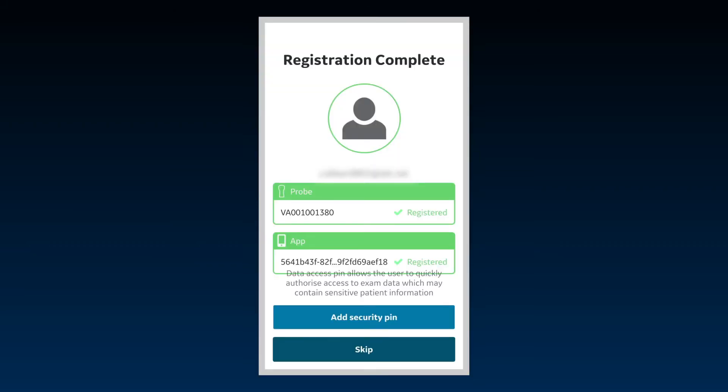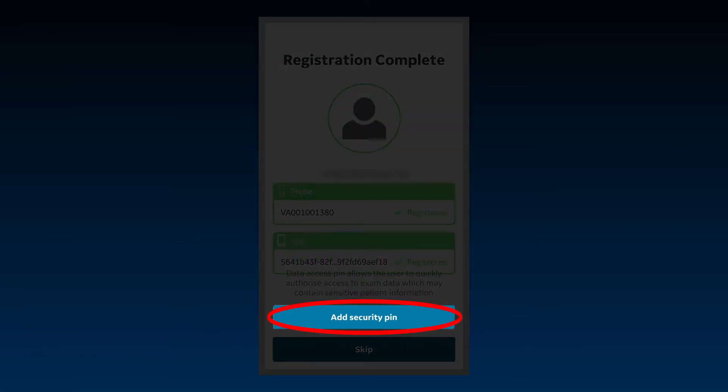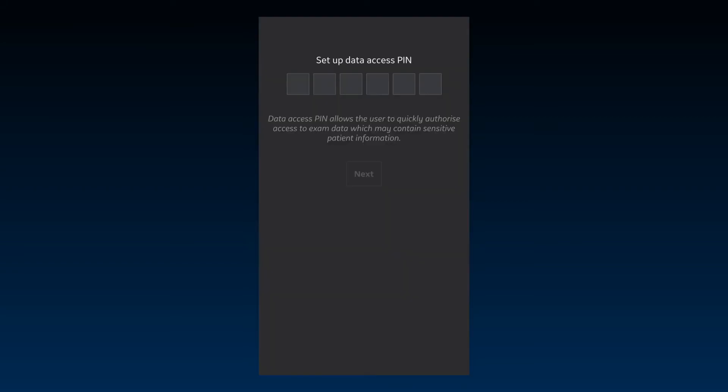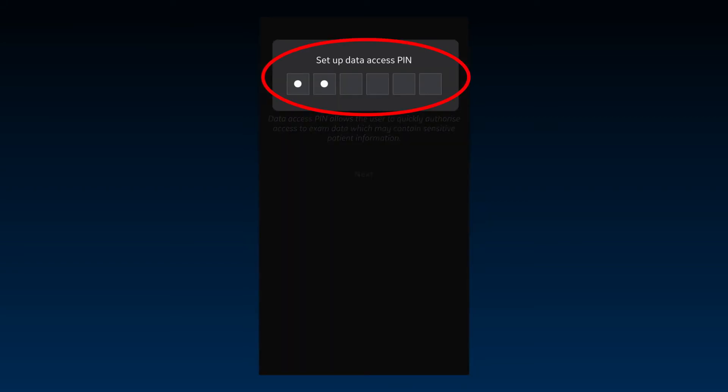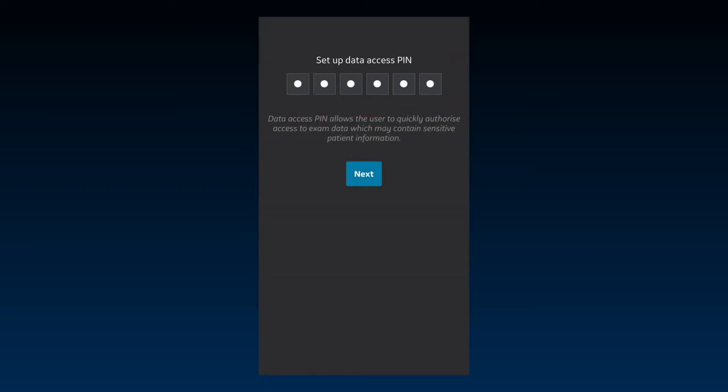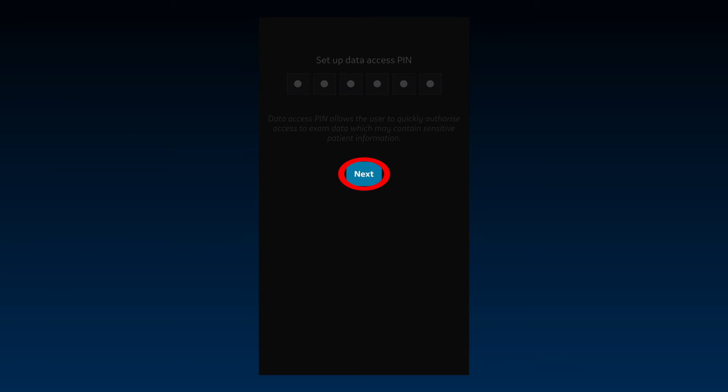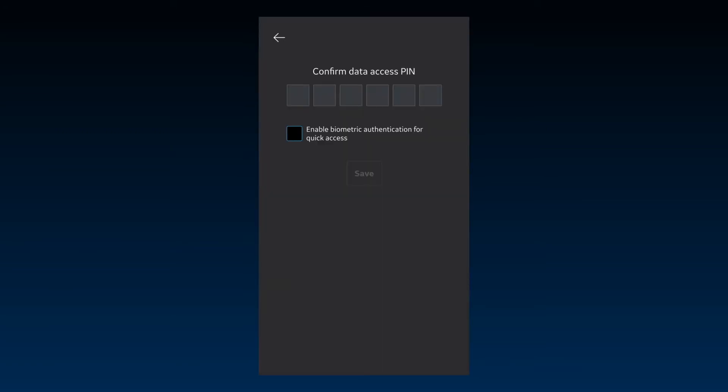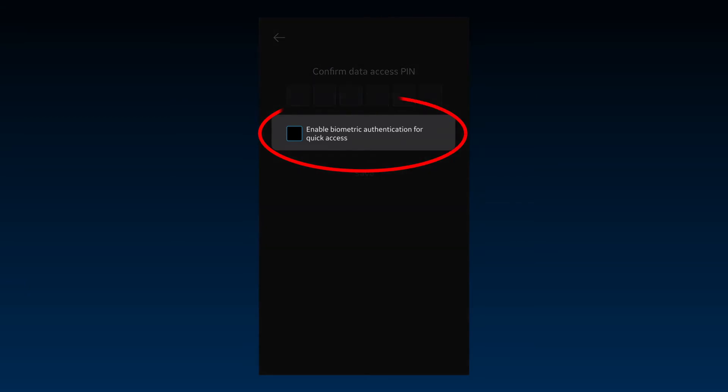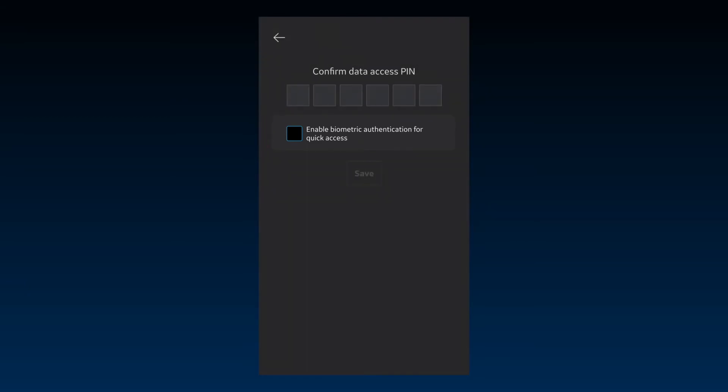You can choose to add a PIN in order to prevent unauthorized access to patient data on the app. Press Add Security PIN and set a strong six-digit PIN. Select Next. For quick access to exam data, there is an option to enable biometric authentication after setting up the PIN.